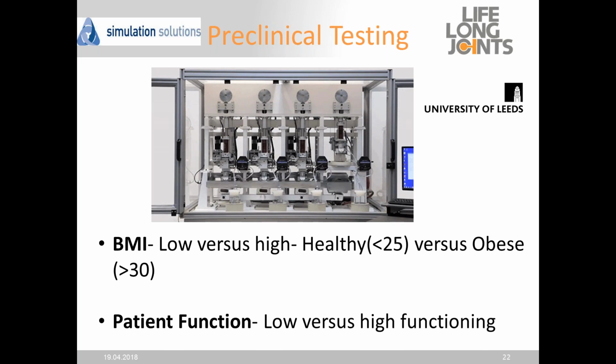It was designed by Simulation Solutions, and early on in the project we actually used some patient data to parameterize the extremes of joint angles and joint forces that we wanted the simulators to run at, beyond the normal preclinical testing ISO standard. So it's been quite nice that we've been able to see it from the concept right the way through to the production.